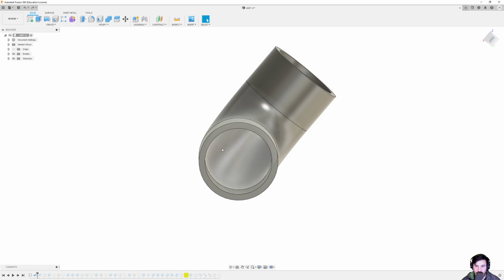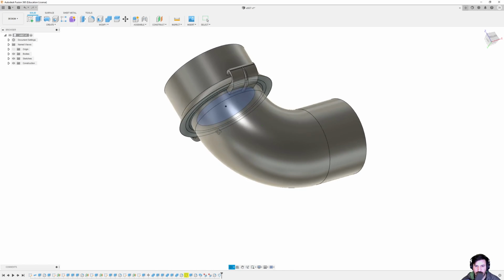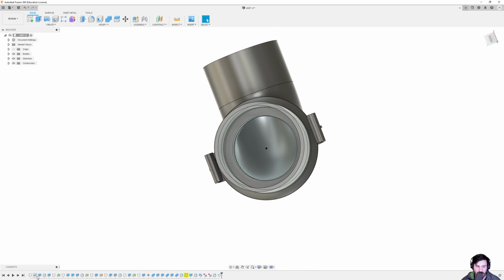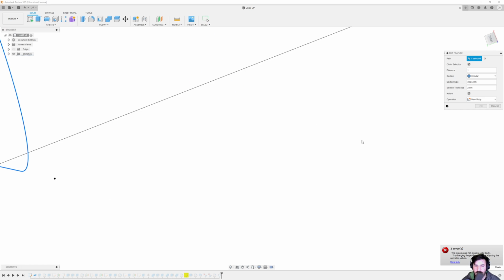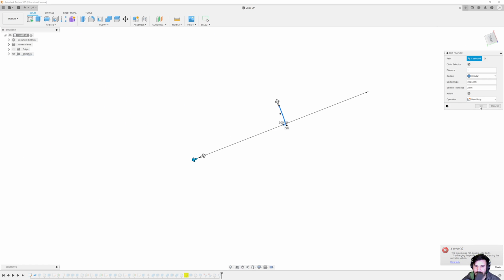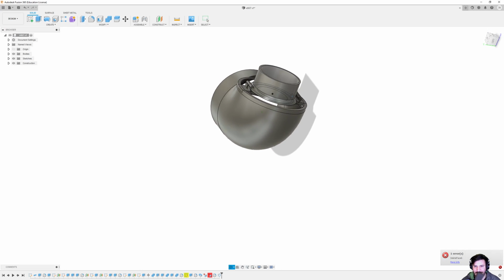So I could redo that, and that changed this, but it didn't change this head, because it was made afterward in the timeline. It changed this interface in here, but because of the way it's designed, that isn't really an issue, unless you go and do something crazy like make this 300 millimeters or something. Even then, look at that. Oh wait, I can't do that apparently. I went too far. If I did 50, yeah, it'll take 50. So there is a limit to what it will do. You can see this front area was not done. While it still connects, it threw an error about certain things.